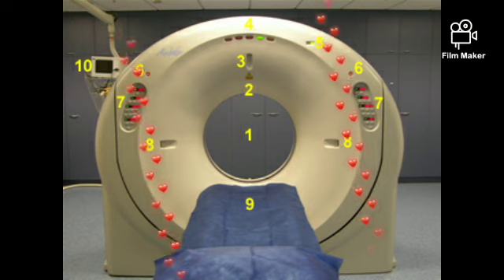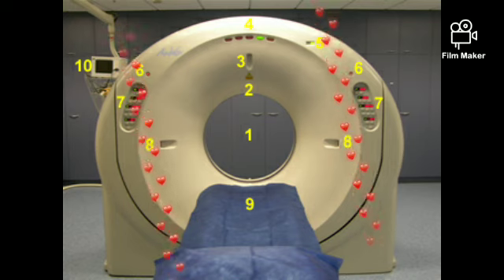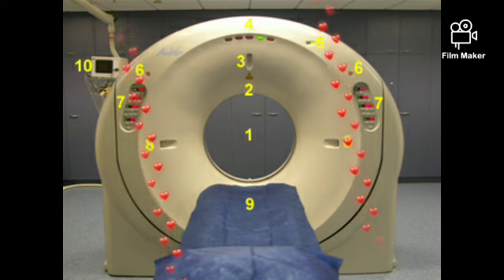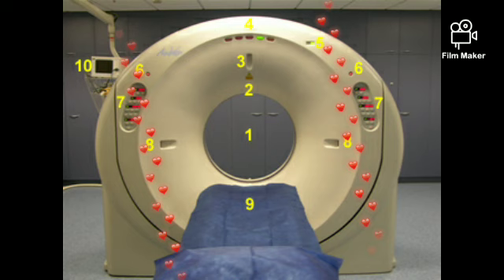Number 10 is my ECG display monitor, and additionally, as I'll show you later, there is an image acquisition display monitor, which is useful for us in doing biopsy cases and any kind of post processing, and it is very helpful for the person who is inside the room. Next you have the option of a pressure injector, which allows us to inject contrast automatically, and that's all the part of the external view of the CT scan machine.